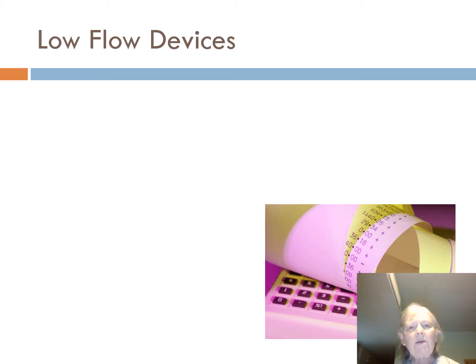What we're going to talk about then is our devices. One of the things you need to know is we have low flow and high flow devices, and there's a definite distinction between the two of them. A low flow device is one that does not provide all the gas the patient needs, and sometimes we'll say it does not meet the patient's inspiratory needs or demands. A high flow device is one that must meet and then exceed what the patient's inspiratory demands or needs are.